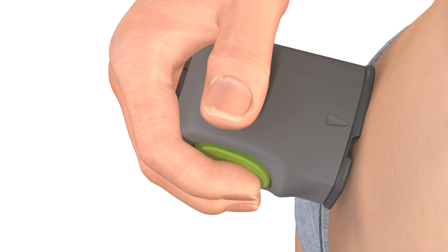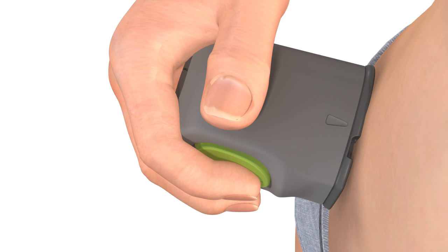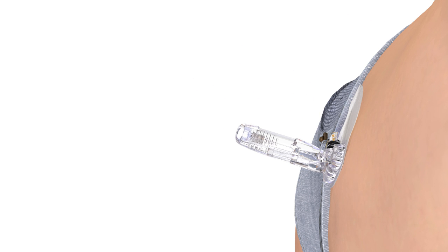Do not pull the Sertor away from your skin yet. Keeping the Sertor flat against your skin, wait at least five seconds to allow time for the adhesive to stick. Remember, you only need to gently place the Sertor against your skin — be careful not to apply too much pressure. Then press the small bump on the green button a second time and continue to hold it in while you slowly pull the Sertor away from your skin.